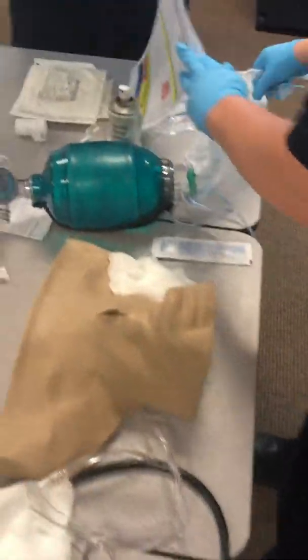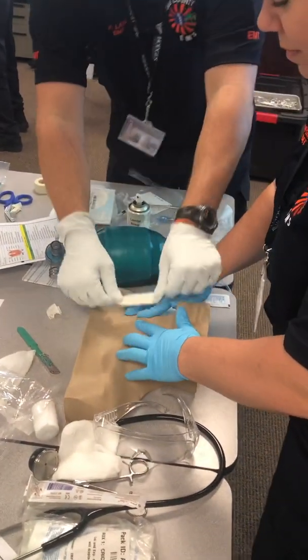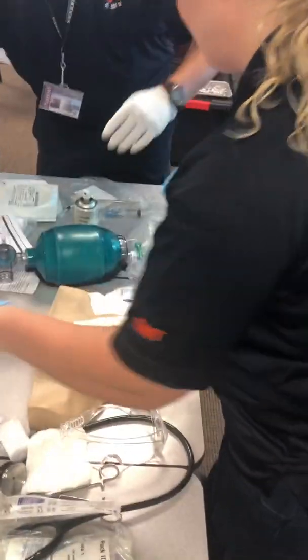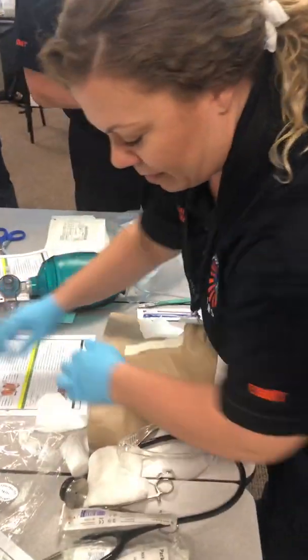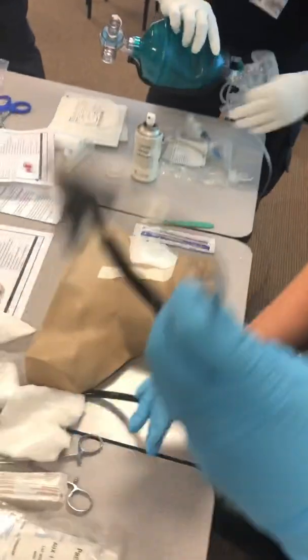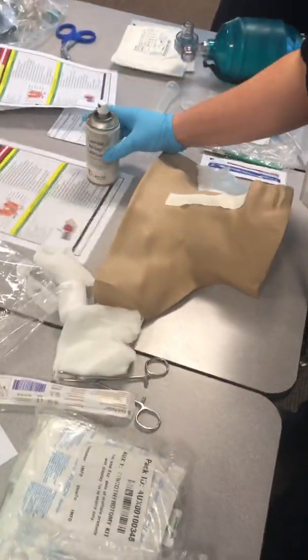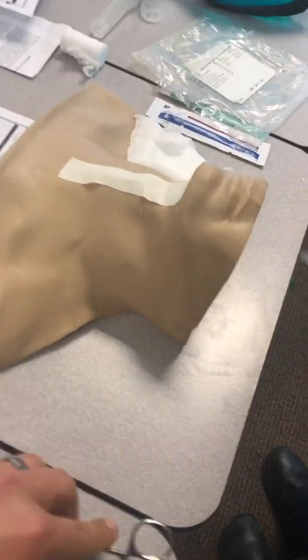This is a last-ditch emergency airway — a surgical cricothyroidomy on an adult patient. Equipment includes eye protection, stethoscope, bag valve mask, dry sterile dressing, scalpel, betadine, lubricant — make sure you lube the tube because it's not going to want to go through there — and forceps.